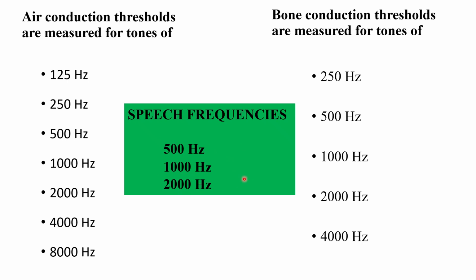These are the frequencies at which we usually converse and hear, because frequencies above 2000 become the high frequency sounds. So our normal routine conversation is between these frequencies. Any effect in these frequencies, the patient will feel the hearing problem more.